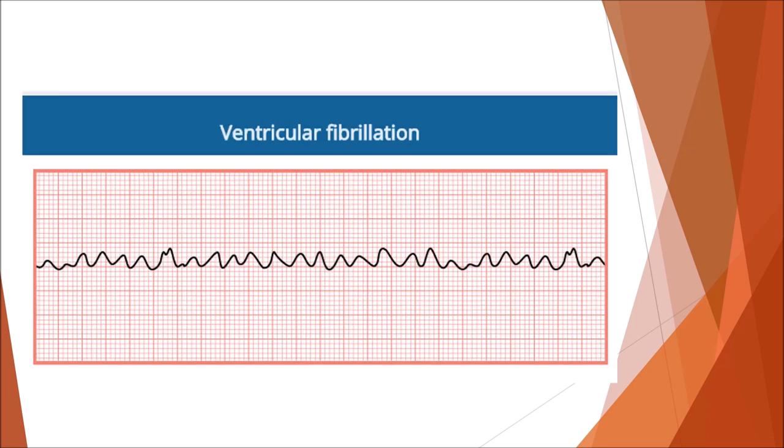That is an AFib. Ventricular fibrillation, also known as VFib. This is a very dangerous arrhythmia because this one can kill you, and it can kill you fairly quickly. Because remember, the ventricles, the ones on the bottom, specifically the left ventricle, pump blood out to the brain and the rest of the body. And if it's not pumping adequately, as happens with ventricular fibrillation, no blood gets to the brain or the organs, and you're going to die. So the ventricles are quivering, and we see all of this randomness. Now, VFib is a shockable rhythm. There's only two rhythms that you would really shock. Now, this is more of an ACLS protocol type of deal, but VFib is a shockable rhythm.